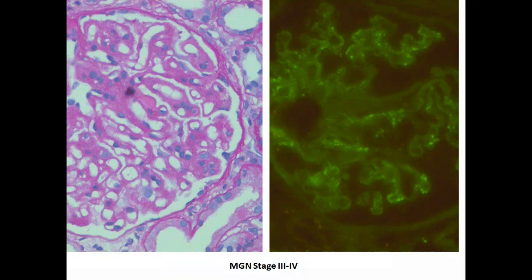So what happens is, if a pathologist looks at this glomerulus at a low magnification, he may miss these minimal kind of deposits which are seen. So you need to go to a higher magnification to see these minimal deposits. Just compare these deposits with the images which I've shown before, which is like 3+ staining, and these deposits are like 1+ staining. So in an advanced membranous, or those membranous patients who are on immunosuppressive therapy, it is possible that immunofluorescence deposits may reduce in intensity, and you can miss them, or you can label them as something else rather than membranous, because you will say there are no immune deposits, but actually you have to go to high magnification to demonstrate these minimal immune deposits along the glomerular capillary.